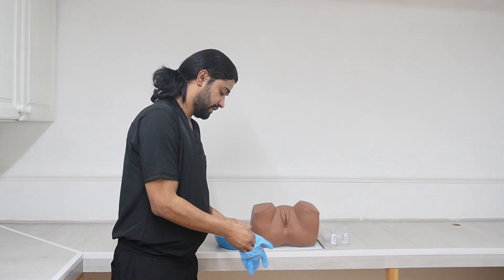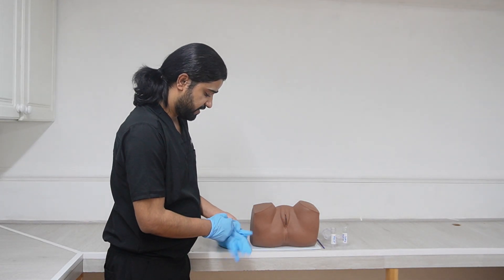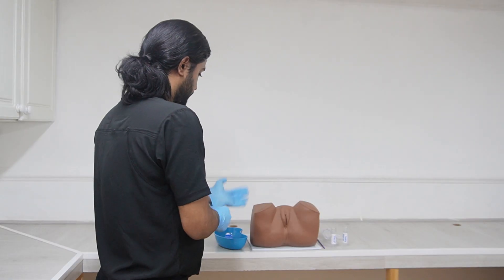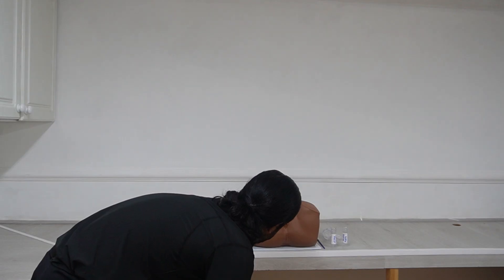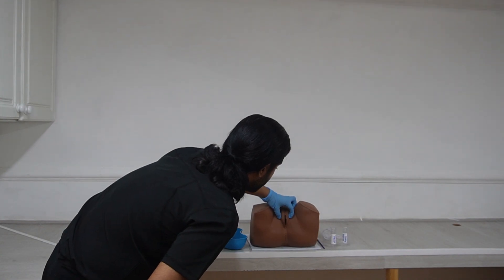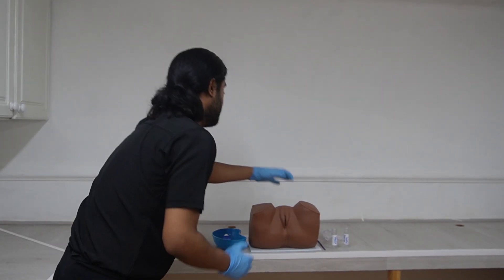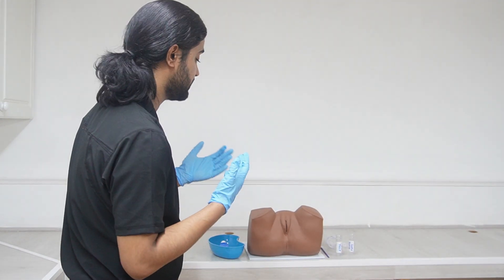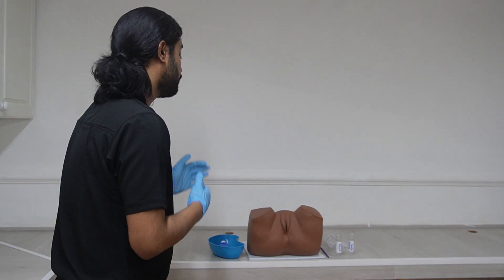First of all we need to wear gloves. After wearing gloves, before starting the procedure we need to inspect. We inspect for the vulva: look for any discharge, any bleeding, any abnormality. Then we part the labia and look for any abnormality. Then we ask her to cough to look for any uterine prolapse. So three things in inspection: looking, parting the labia and looking, and then asking her to cough.